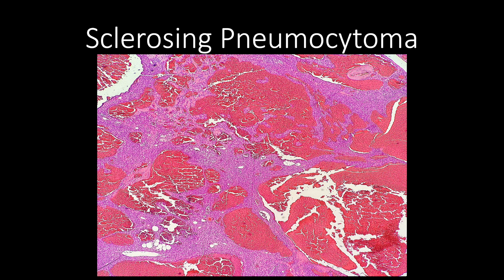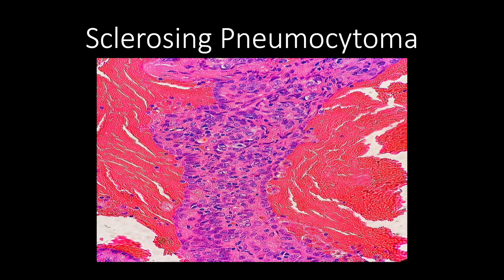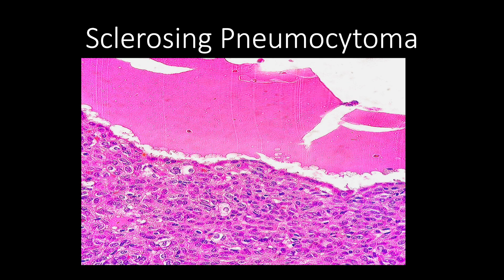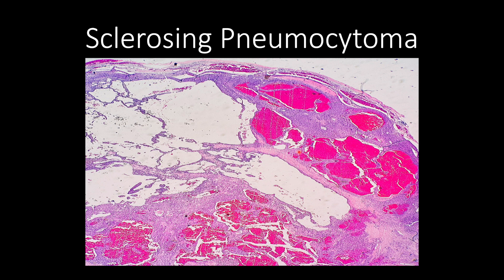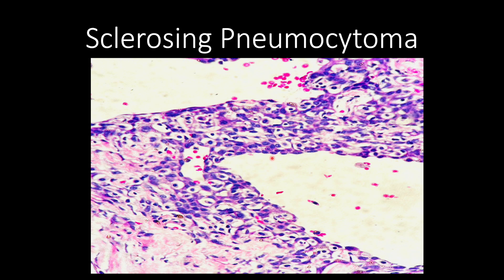This is another sclerosing pneumocytoma where the predominant architecture is hemorrhagic. Let's delve closer into the cells surrounding the hemorrhage. You can see your surface cuboidal cells resembling your type 2 pneumocytes, as well as your round stromal cells. Here's another image showing surface cuboidal cells and round stromal cells, and another case that is predominantly hemorrhagic as well.